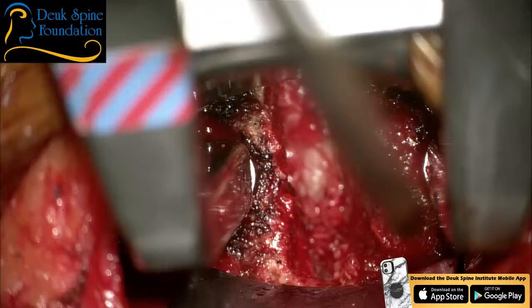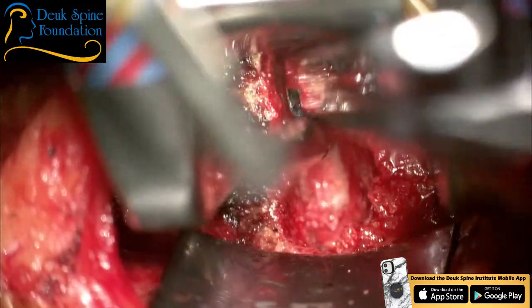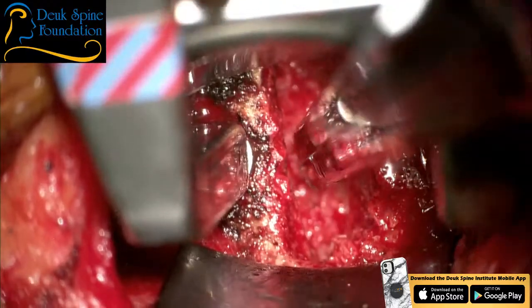But we've listened to, that was a big herniation right there. Look at all that scar tissue right on top of the spinal cord and dura. Crazy.